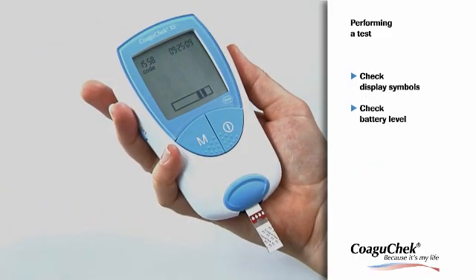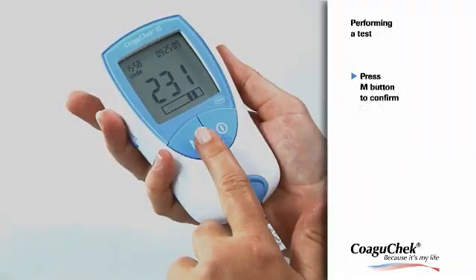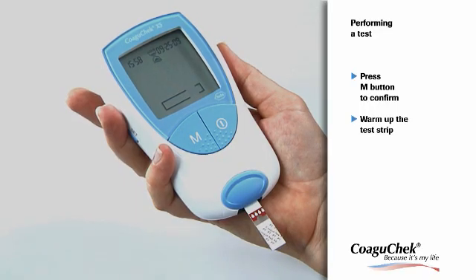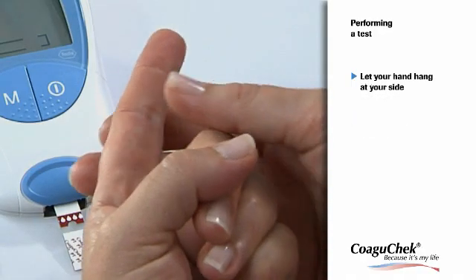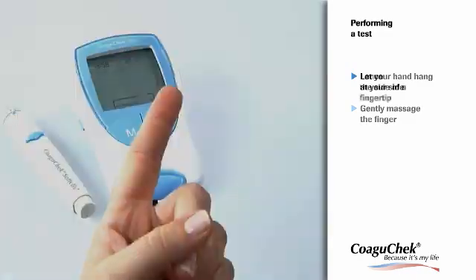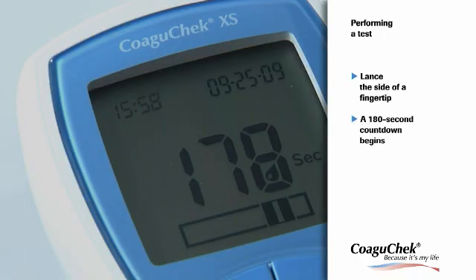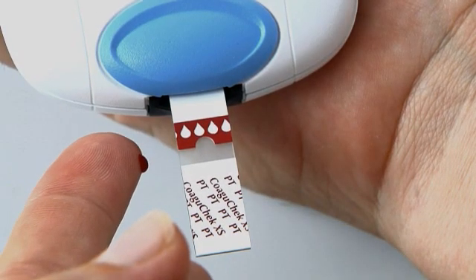The code number of the code chip inserted is displayed. Make sure that this number is identical to the code number printed on the test strip container. Press the M button to confirm that the two numbers are identical — using the wrong code chip can produce inaccurate results. The code number stops flashing and the test strip begins warming up. This is the perfect time to start getting your blood sample. Before you lance, let your hand dangle for a moment, then gently massage the finger.